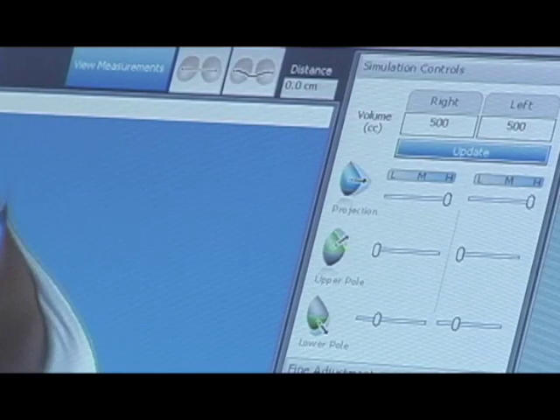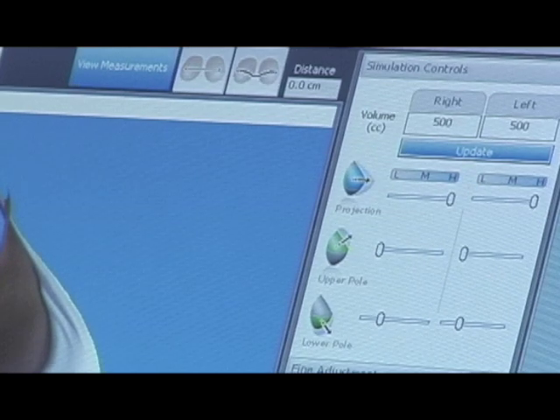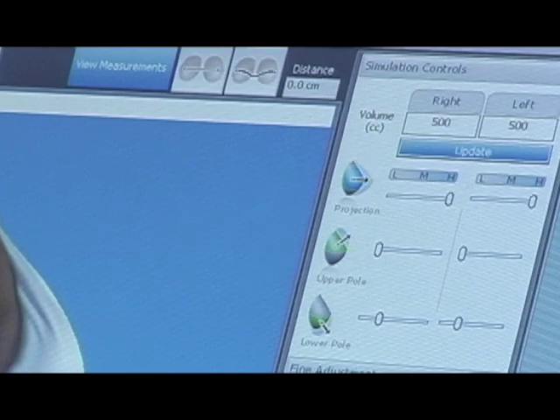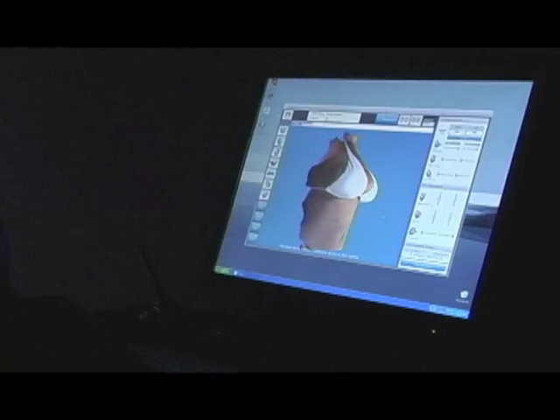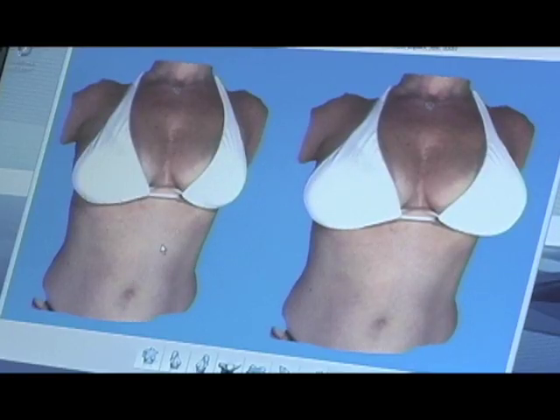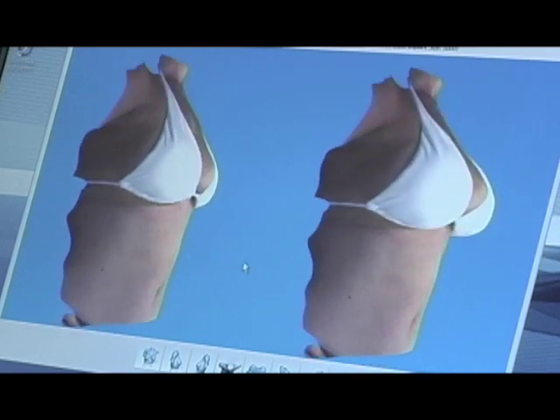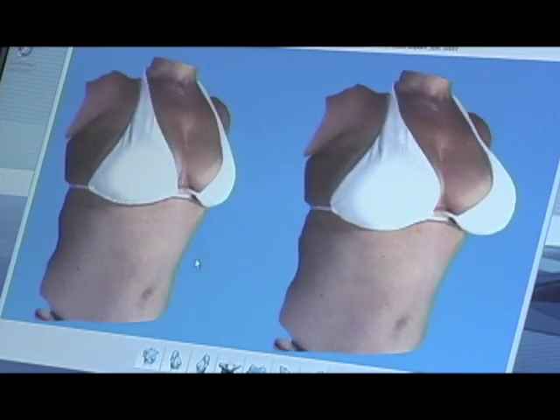Now with the breasts outlined and the measurements checked, we can simulate the actual breast augmentation. Here I'm going to tell the computer to simulate a 500cc implant on both sides. We click the update button, and there you can see the difference. It's also possible to look at the patient before and after the simulated breast augmentation on both sides, turning both torsos together. Patients find this to be a very useful view to get an idea of the breast augmentation size that they're looking for.